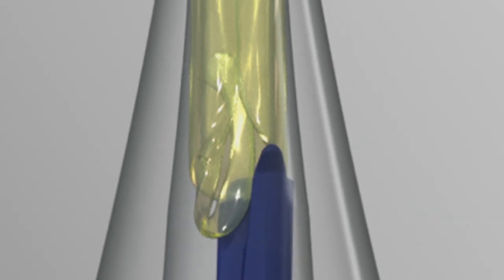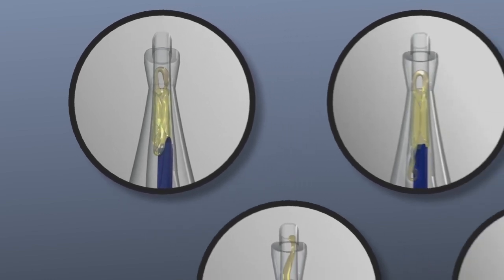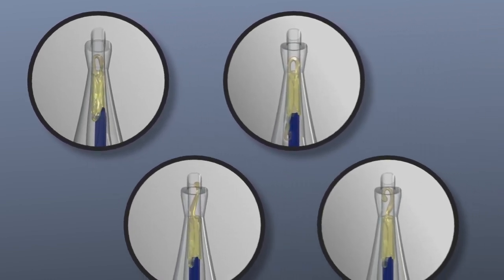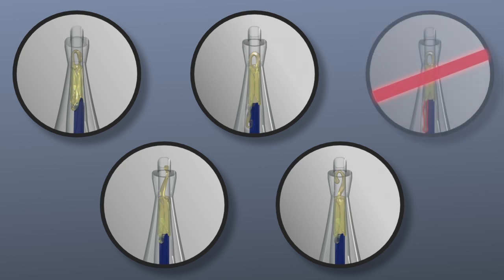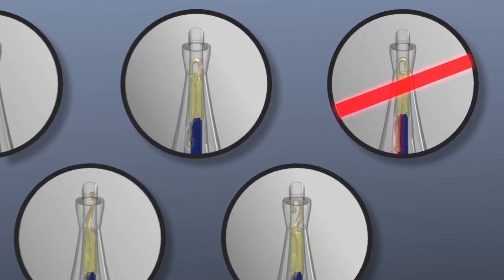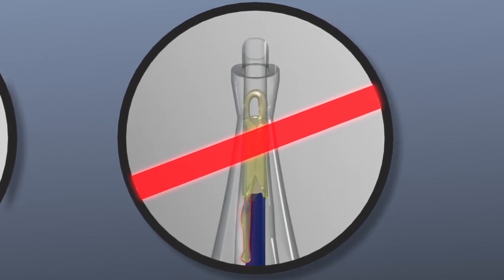There is clearance on the left upper portion of the plunger to allow room for the folded haptic. Once the correct position of the plunger is confirmed, inspect both the leading and trailing haptics per the package insert. The do-not-proceed configuration occurs when the trailing haptic extends straight down from the optic. Since this trailing haptic is trapped, the IOL cannot be fully delivered, so implantation should not be attempted.